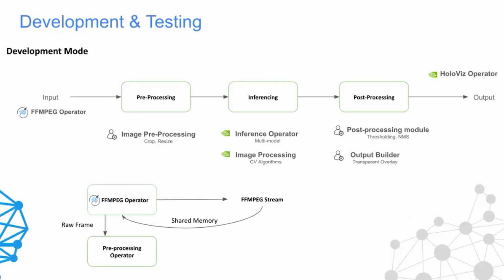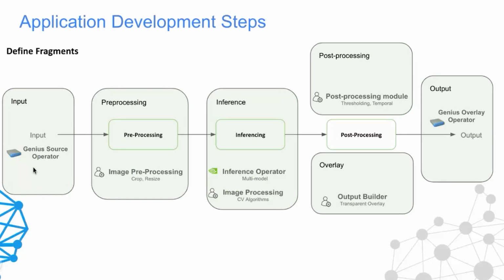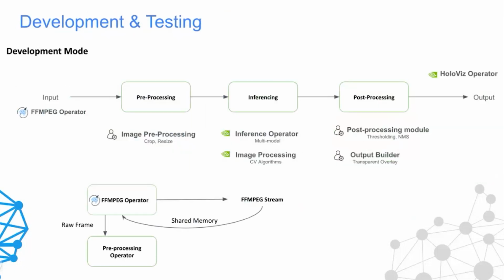So over here, as we see, input and output are provided by the edge device that we are going to use later to deploy on. But for development, since you are going to do it on your own system, it is recommended to use some other operators that can help you. So we built this FFmpeg operator that helps us stream from any other V4L2 source or from a video file. And for the output, we are using the inbuilt HoloViz operator that comes along with the Holoscan SDK.